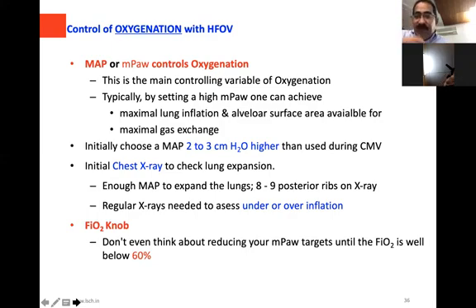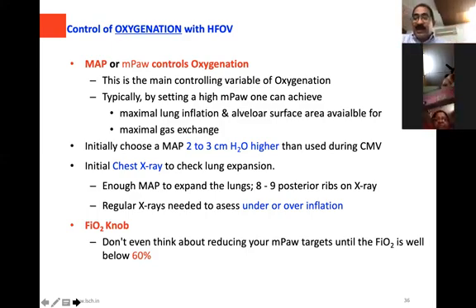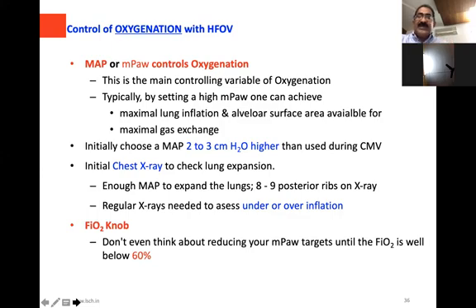And then you need to see how you recruit the lung. I will talk briefly only about recruitment because the next class is one topic only about recruiting the lung. Many of the doctors or my PGs or my students keep telling me, yes sir, we've got the baby on the oscillator, it's wiggling well. That is not the only important thing. It's not only important that you get a good wiggle, but until where you get a wiggle. It's a complete thing. There are 4 things that you need to see. First, look at the baby, look at the monitor, look at the X-ray, and look at your investigations last.